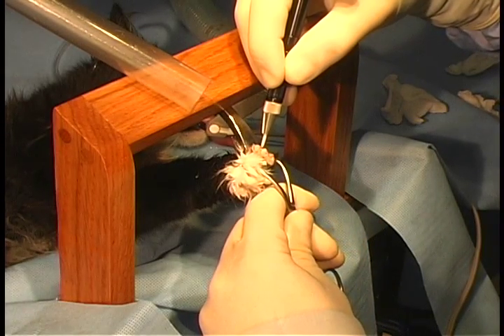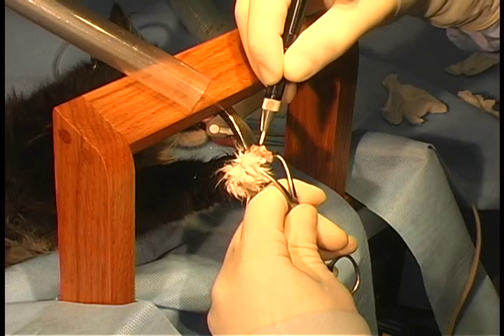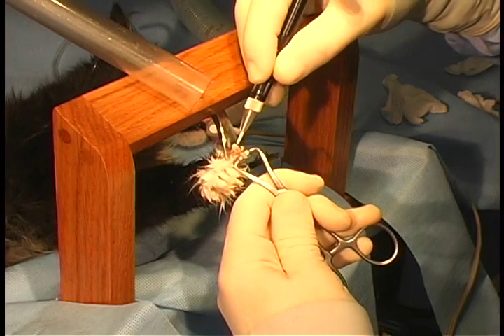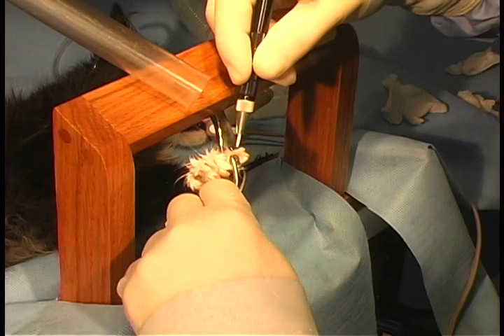The frame also provides a place to support your hand while guiding the laser, and the stainless steel guide will rotate with each individual claw to allow maximum exposure to the joint.